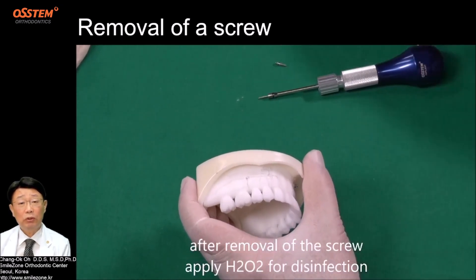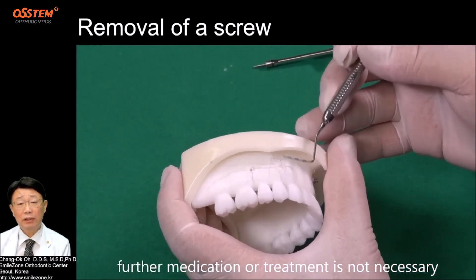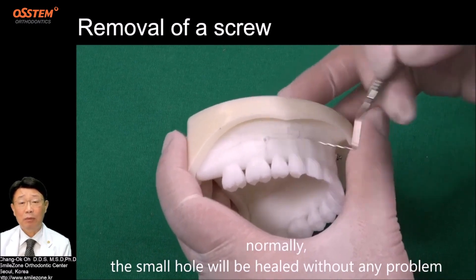After removal of the screw, apply H2O2 for disinfection. Further medication or treatment is not necessary. Normally, the small hole will be healed without any problem.